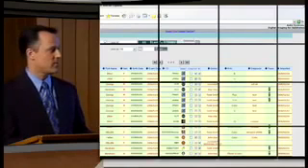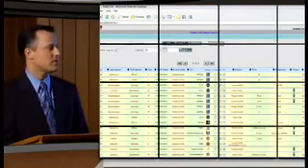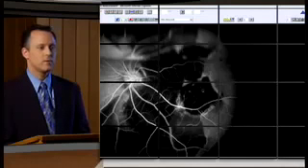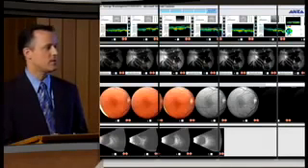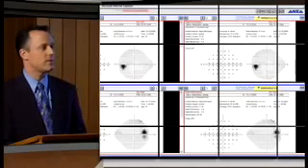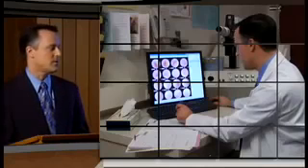When I'm in the exam room with a patient, I can simply type into the computer to a local web address, pull up their photos by name, search for all their reports, including ultrasounds, OCTs, clinical photos, and Goldmann visual fields, all within one search with a few clicks of the mouse and a few inputs on the keyboard. And what this allows me to do is very quickly tell a patient or show a patient the results.